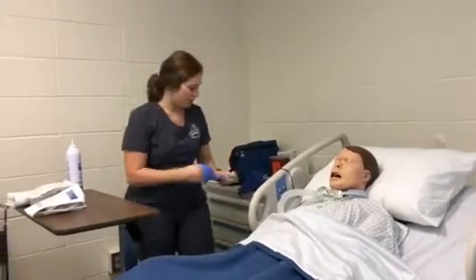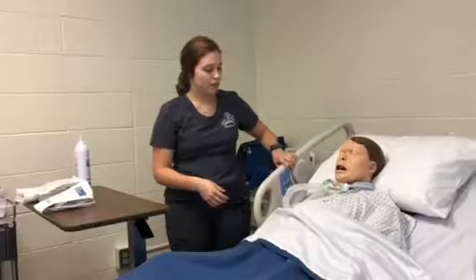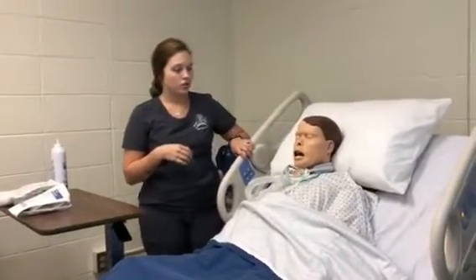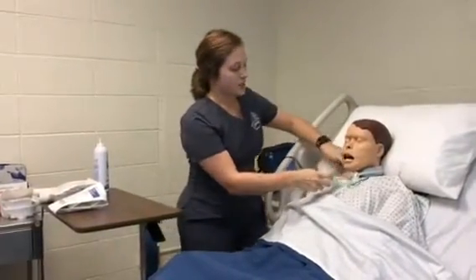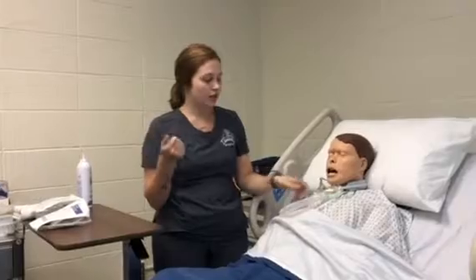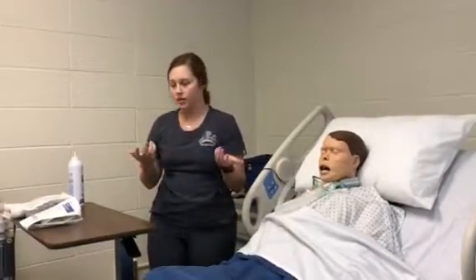And before we go any further, we are just going to raise him up into high Fowler's position. And this just makes it easier on the patient and easier on me to complete the procedures that we need to do today. Okay, we're going to wash our hands. And now we're going to get started with the suctioning portion. This is a sterile procedure, so once I get all my stuff on, I will have one unsterile hand and one sterile hand.